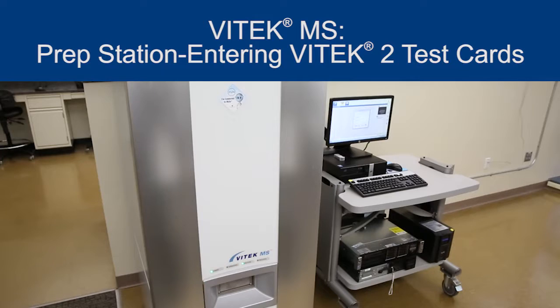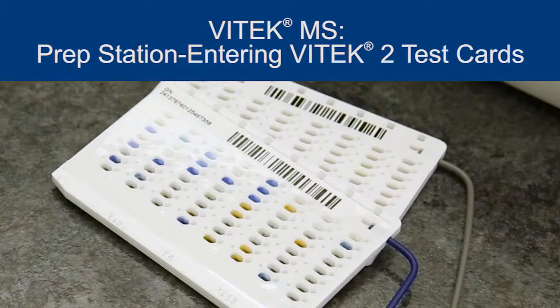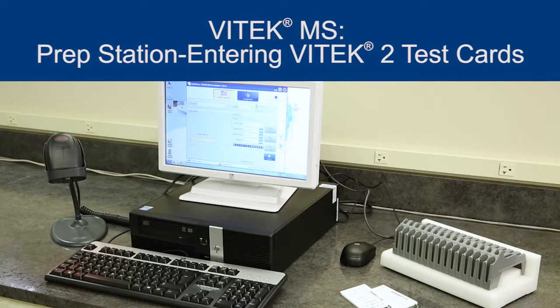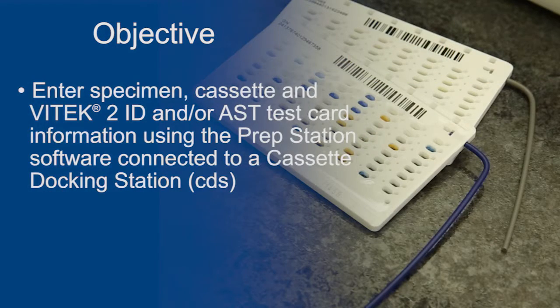The purpose of this video is to explain how to use the PrepStation software to enter specimen, cassette, and VITEK 2 identification and/or antimicrobial susceptibility test card information for testing on the VITEK 2 instrument. Depending on your laboratory workflow, this information can be entered before card setup, concurrently with card setup, or after card setup. At the end of this video, you should be able to enter specimen, cassette, and VITEK 2 ID and/or AST test card information using the PrepStation software connected to a cassette docking station.